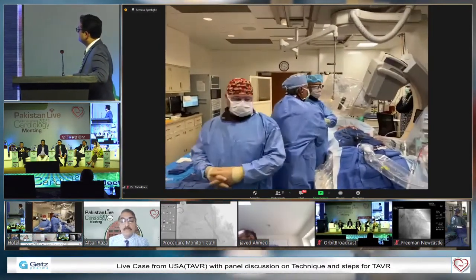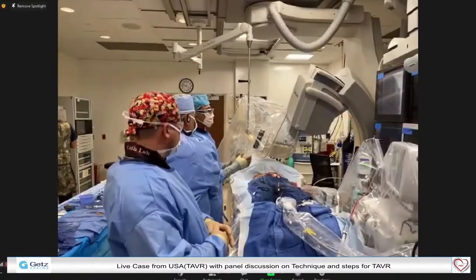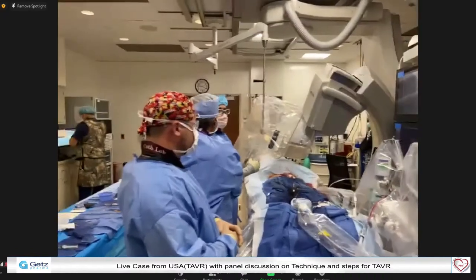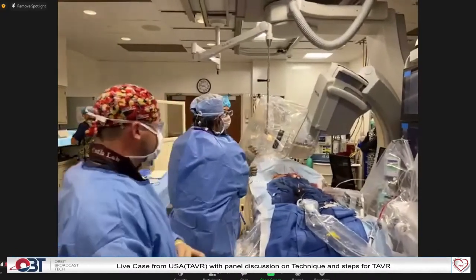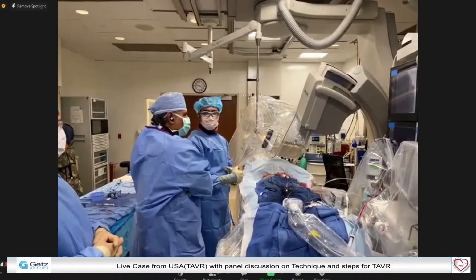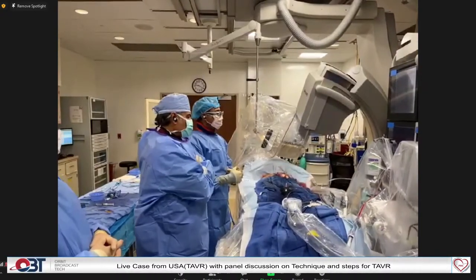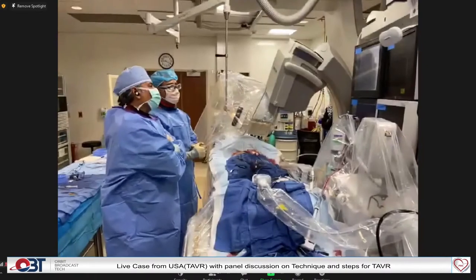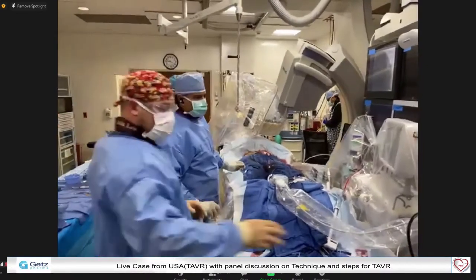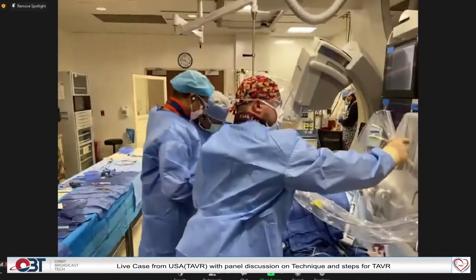Naveed, so the size looks pretty good. Anything special? No, we were thinking that before the IVUS, if you want to post-dilate it with a 4.0 non-compliant balloon, especially the ostium, but it looks like the position of the stent is really good. Very good, and probably there is no need to do any. Right. So we'll take the Impella out, and let's take another picture of the fluoro. Can you go on 30 frames per second and give me 512 so we can look at it very well?